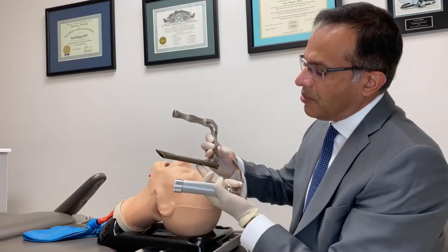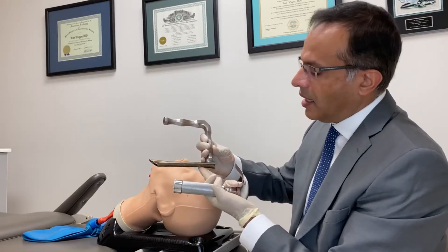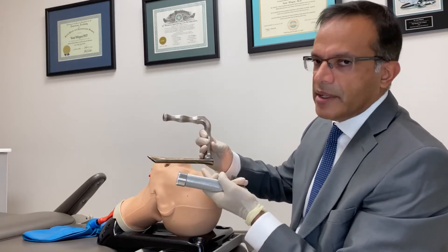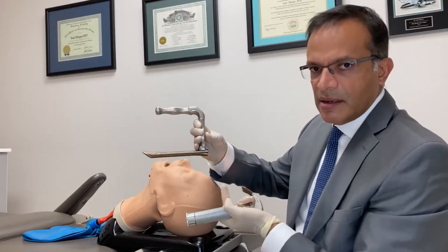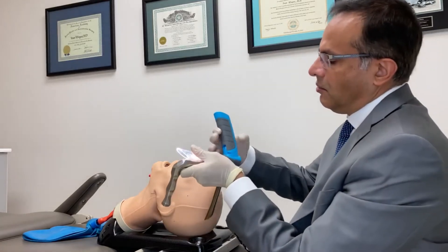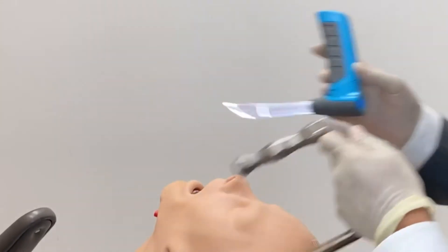This is the predicate device for our v-scope, which has been around for over a century. We use this to this day to examine and gain access to the airway. One thing we always tell everyone: when using this device, we don't just rest metal against the teeth — there's a rubber tooth guard that protects the teeth.